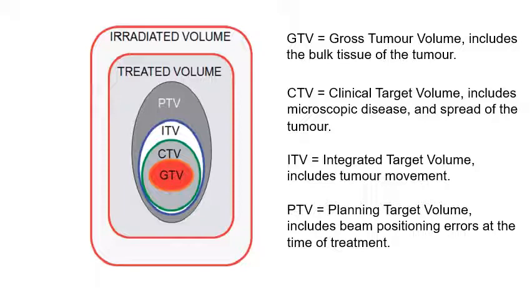The ITV, or integrated target volume, was added recently, and this accounts for tumor movement. The PTV, or planning target volume, includes beam positioning errors at the time of treatment.